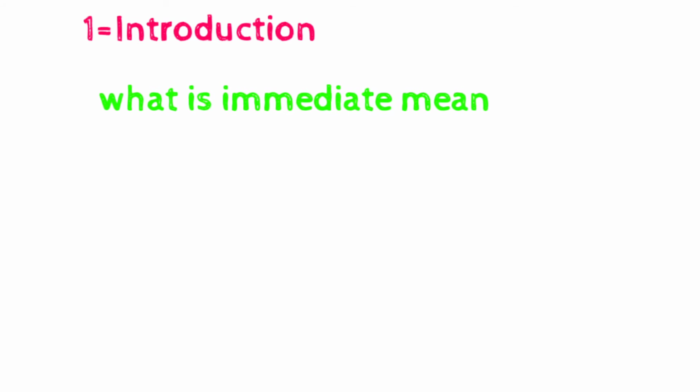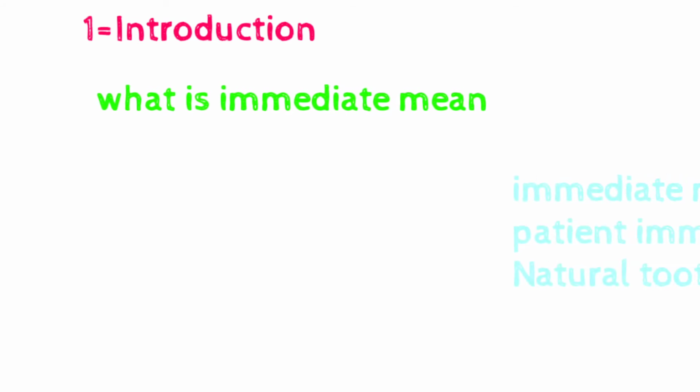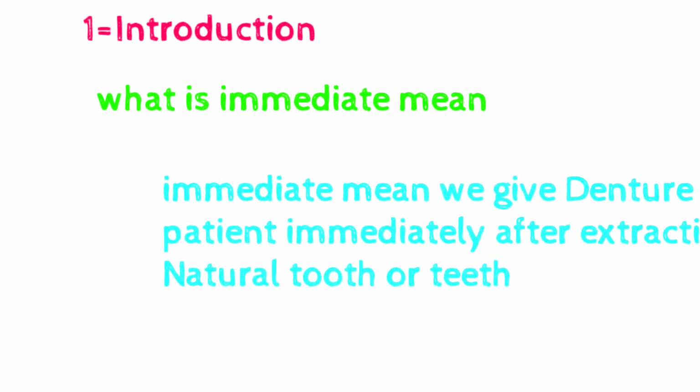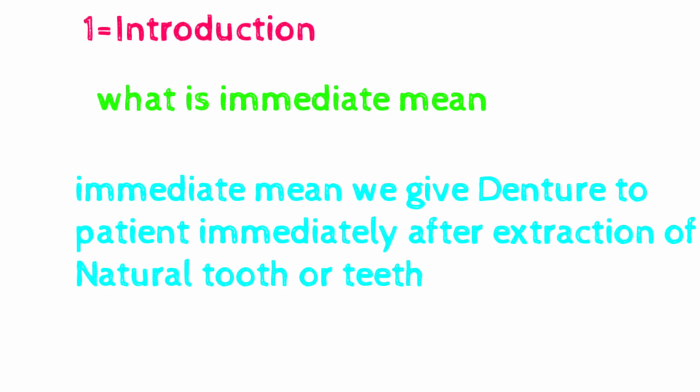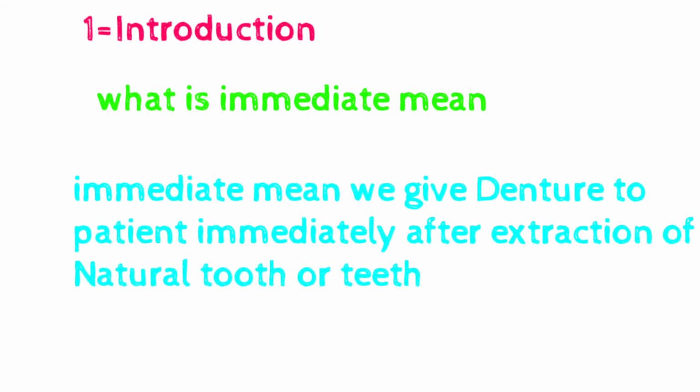First we start from the introduction. In the introduction we will study what immediate means. What does immediate mean? Immediate means we give the denture to the patient immediately after extraction of the natural tooth or teeth.